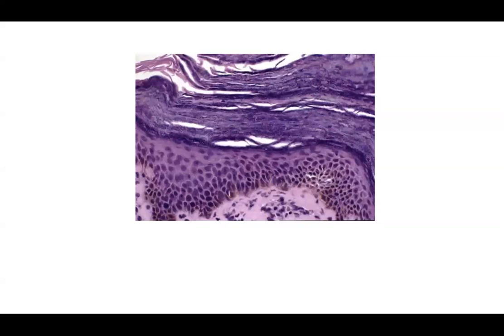Instant recognition: you can see many granules within the stratum corneum, with retained nuclei but abundant granules — it looks like an extension of the granular layer within the parakeratosis. This is called granular parakeratosis, and it occurs typically in the axilla — axillary granular parakeratosis. Review it clinically; it looks similar to other entities and biopsy is key.